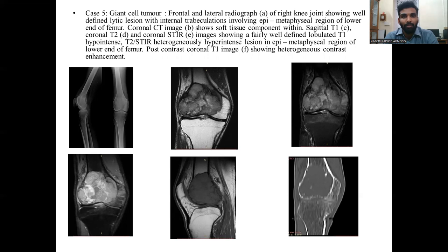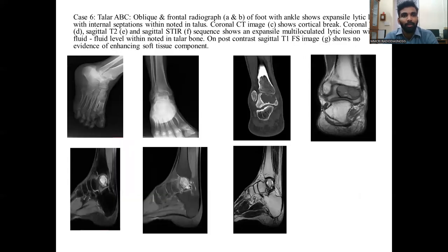Case of giant cell tumor. Frontal and lateral radiograph of the right knee shows a well-defined lytic lesion with internal trabeculations involving the epimetadiaphyseal region of the lower end of femur. Contrast coronal T1 images show heterogeneous contrast enhancement. Case of talar aneurysmal bone cyst. Oblique frontal radiograph of the foot and ankle shows an expansile lytic lesion with internal septations noted in the talus. Coronal CT shows cortical break. Coronal T1, sagittal T2, and sagittal STIR images show an expansile multiloculated lytic lesion with fluid-fluid levels within the talar bone. Post-contrast sagittal T1 fat-sat images show no evidence of enhancing soft tissue component.